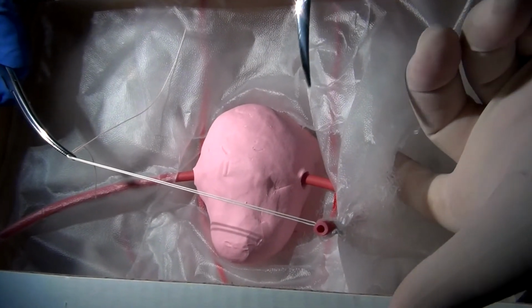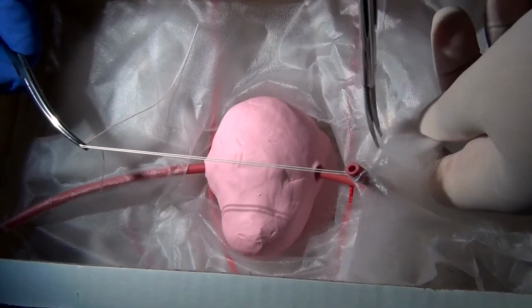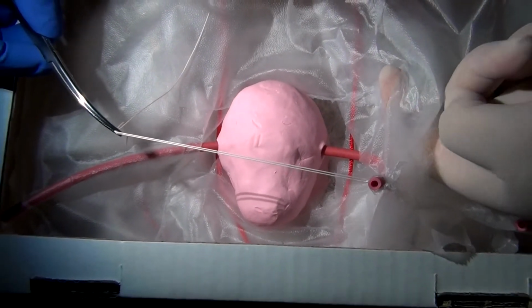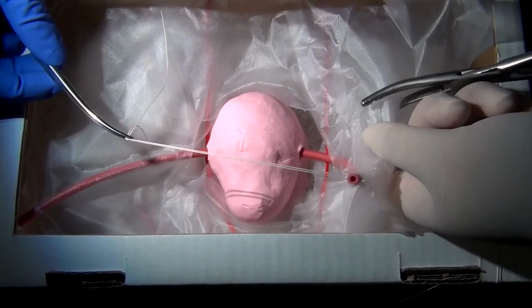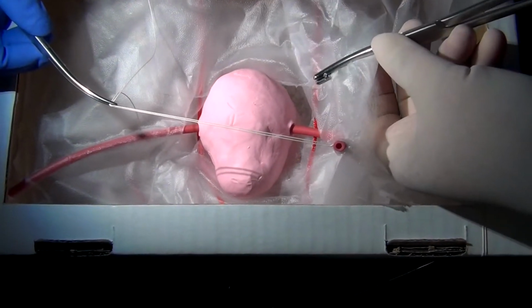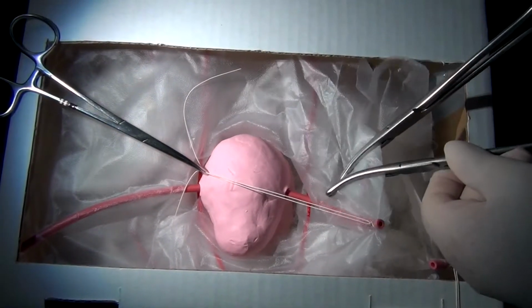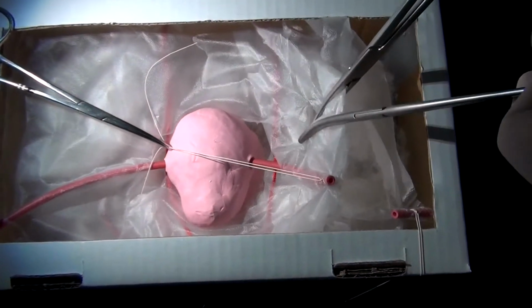So now, with my finger, because this would be your peritoneum, I'm going to make a defect through my peritoneum. Normally we would both be on our finger. I'm going to create this defect. Haney, so curved Heaney-Valentine is used. Heavy crushing forceps. So I'm going to clamp. My next step, again coming through my peritoneal surface, I'm going to clamp. My ureter still is distal to my clamps.